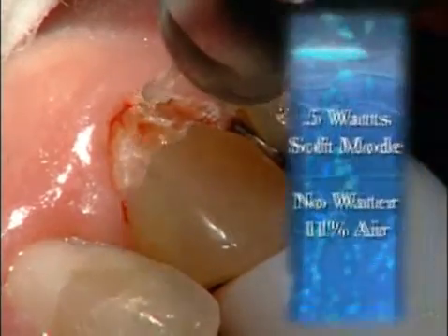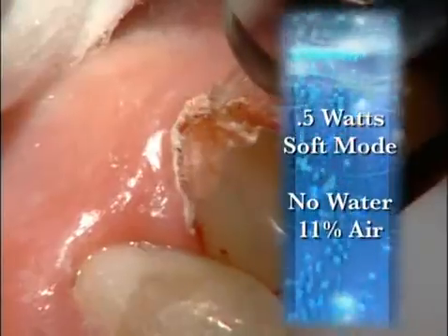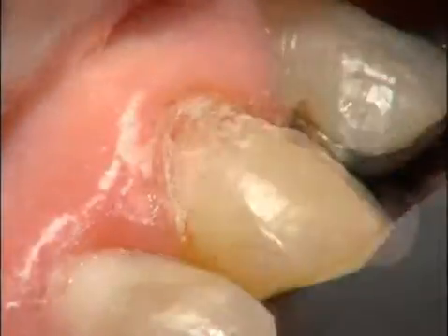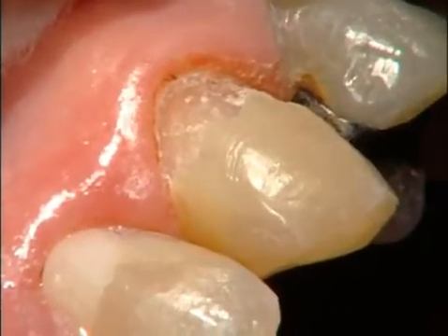I'm coming in now at a half a watt on the soft mode, 11% air and no water to clean the tissue up and coagulate.